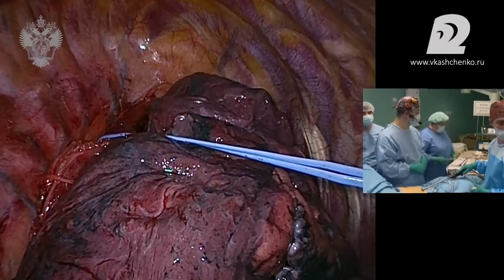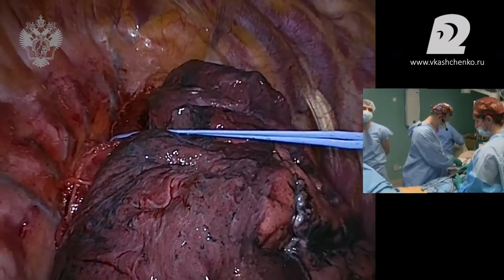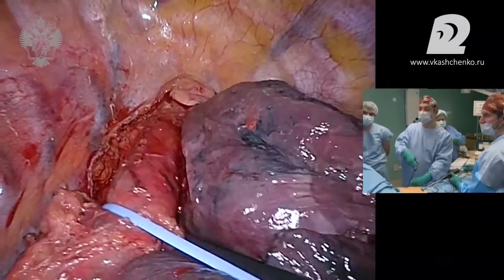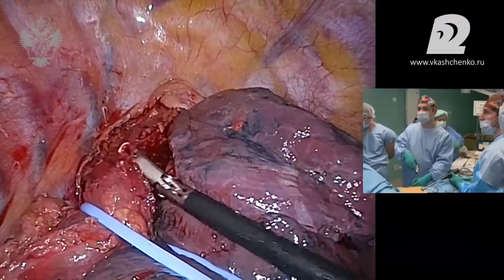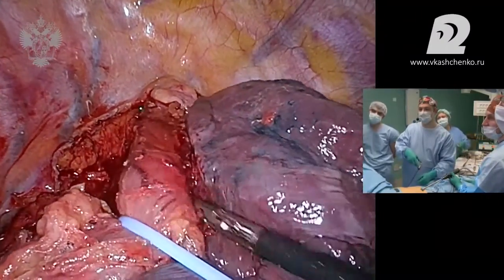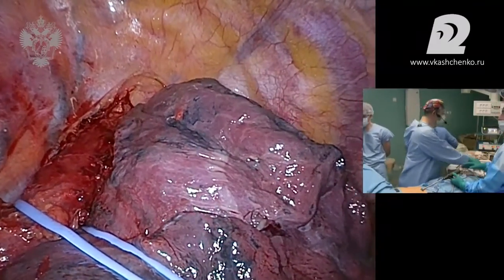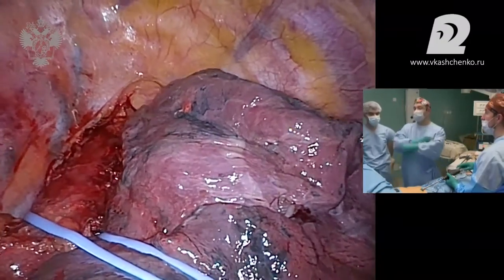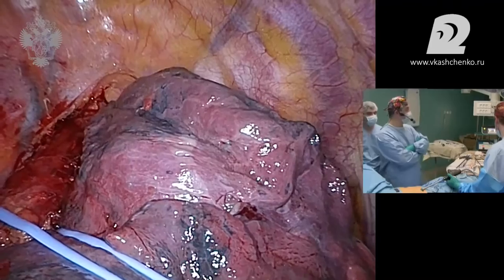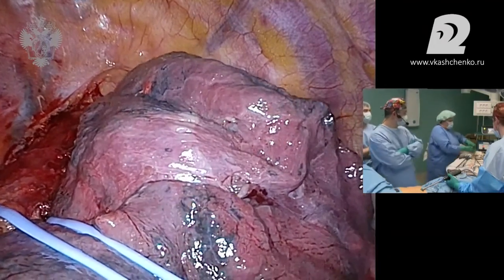Give me, please, green cassette 60. Yes. We'll cross. Have you tightened it? Closer. Intercostal. Could you please prepare a kind of ribbon that will stitch it? We'll use it for the crossed cranial pole and then for the crossed caudal, a kind of string so that we could maintain the prolongation of the esophagus.